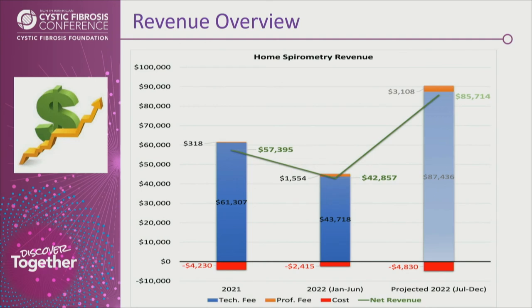The prof fee, which is the analysis, which would be tied to the recommendations, did not necessarily equate to much. It was only $318. It's quite minimal. We were quite disappointed. But nonetheless, the data was necessary for clinical care, and there were certainly a lot of changes to medical management and/or improvement or response to therapy, so it was still beneficial for use.